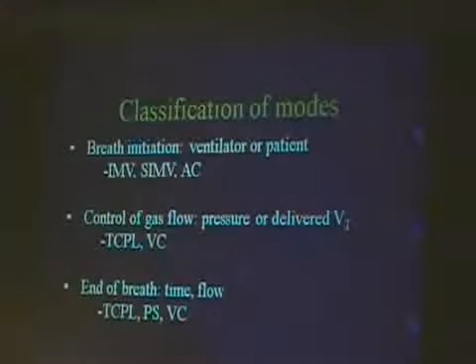Now, it's important during conventional ventilation to understand your ventilator. All kinds of different terminologies are used depending on the ventilator, but you really can take it down to fairly simple ways of classifying what's going on. And that's important when we get to volume guarantee ventilation, because it's very confusing. So I want you to understand what's happening. For the modes of ventilation, there are three things you have to think about.